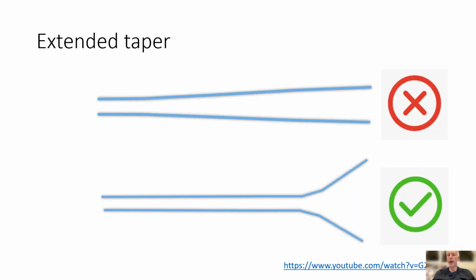Sometimes the taper can be found to be drawn out over several centimeters. In this case, it is unclear at which position along the taper the JVP is located. I'm trying to demonstrate this here with the image up top. This has been described with the traditional physical exam as well, where the JVP pulsation can be diffuse and along the entire length of the neck. In this case, increase the incline of the head of the bed. Gravity will pull the column into a shorter and more acute taper.